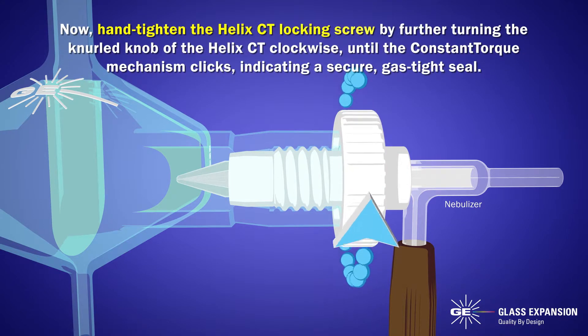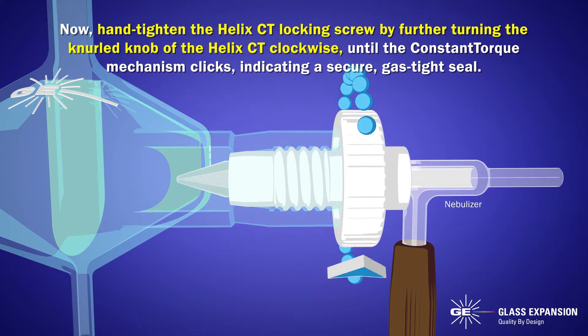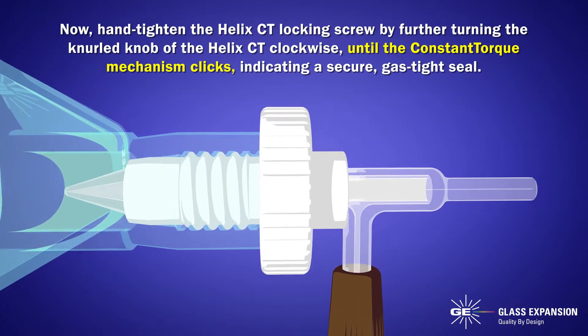Now, hand tighten the Helix CT locking screw by further turning the knurled knob of the Helix CT clockwise until the constant torque mechanism clicks, indicating a secure gas-tight seal.